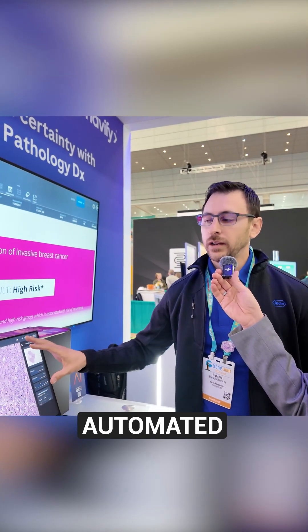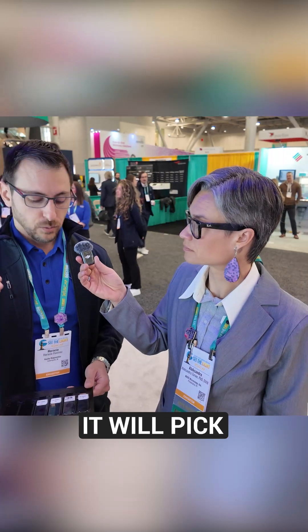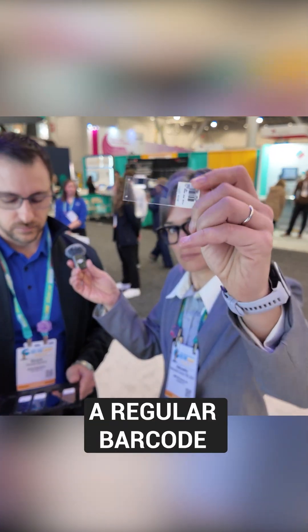In a fully automated workflow, the system will be connected to your LIS — the Lab Information System. The scanner has a barcode reader inside, so when you put in the tray, it will pick up the barcode of the slide, which I'm showing. That's a regular barcode, but we can also take QR codes and similar formats. Then it will send images to the cloud and build the case with images corresponding to that specific case in the LIS by itself.